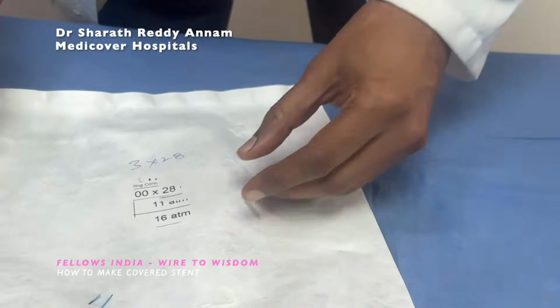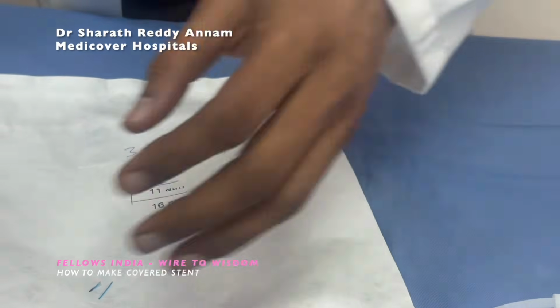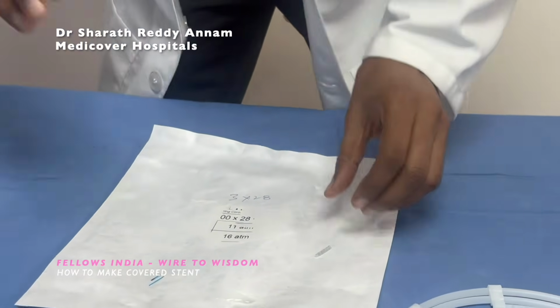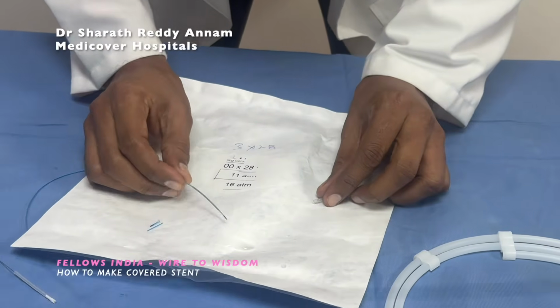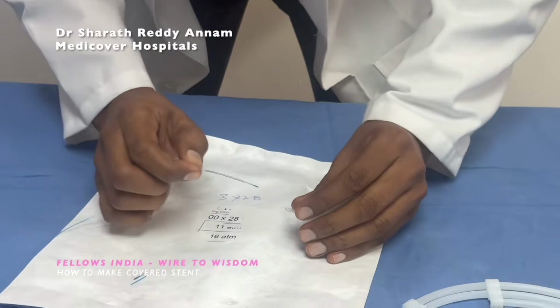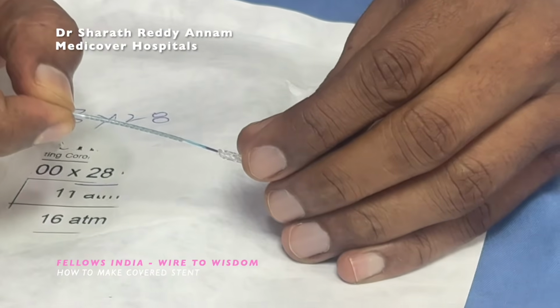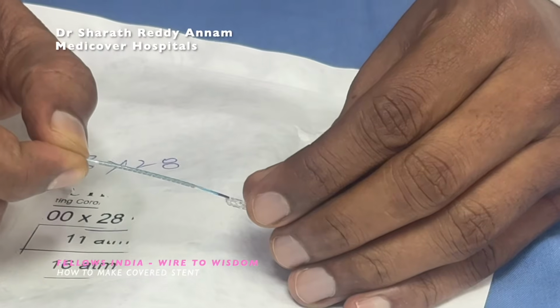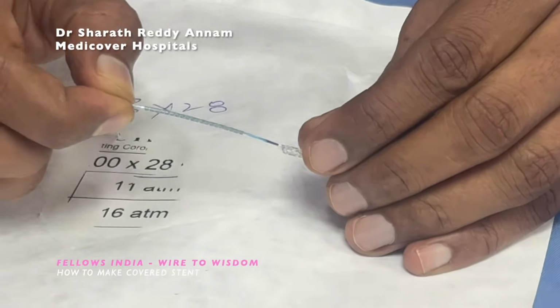Now what we'll do, where is the next stent? The stent longer than your covered stent size. So this is the longest stent, and introduce this longer stent.